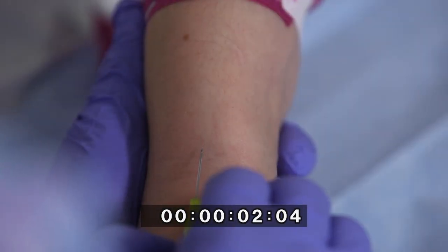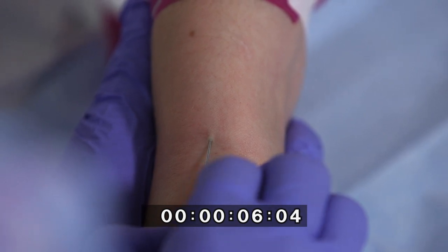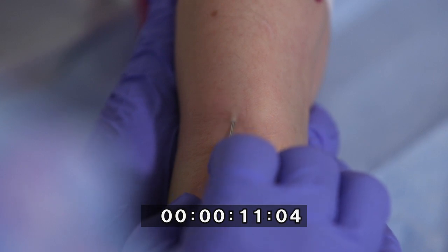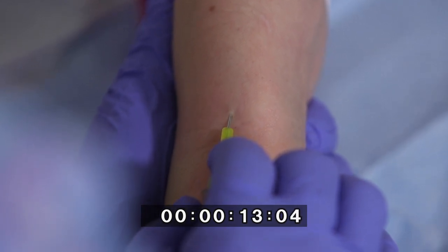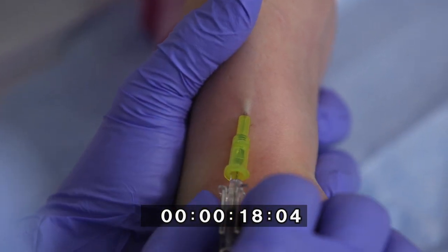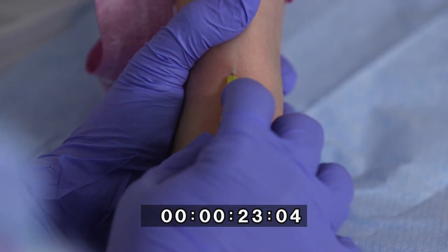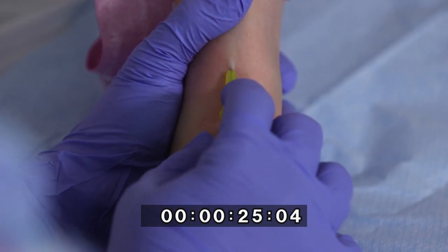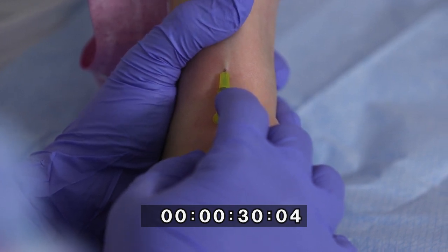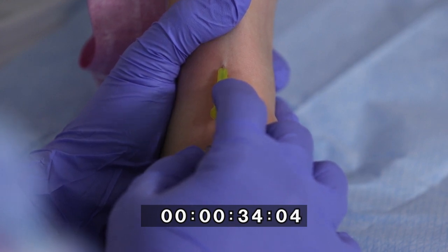Nurse Emma continues with the PIVC procedure. When the cannula punctures the vein, she observes for flashback in the cannula chamber as appropriate. She advances the IV cannula a further 2 mm along the lumen of the vein. She withdraws the introducer slightly with the dominant hand, and a second flashback of blood will be seen along the shaft of the cannula. She slowly advances the IV cannula fully into the lumen of the vein.